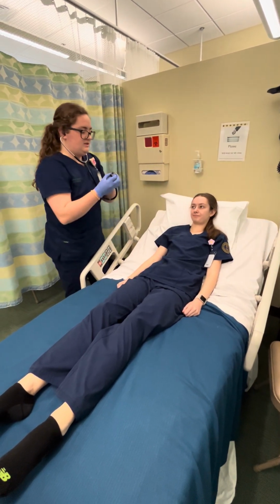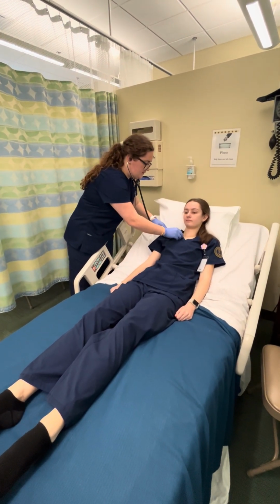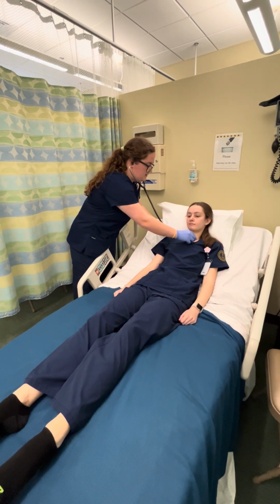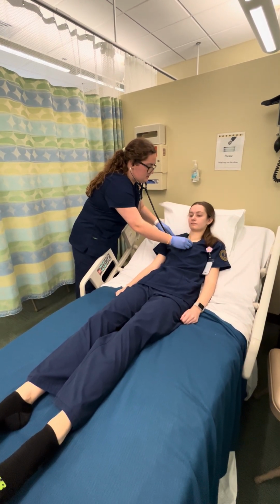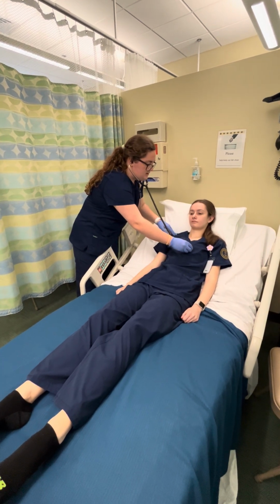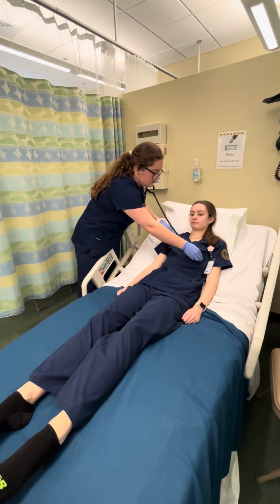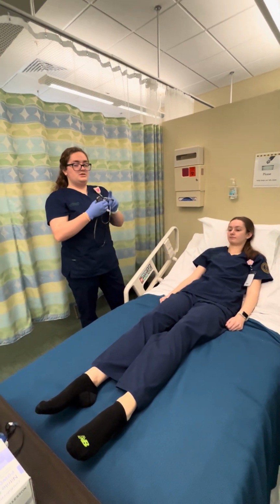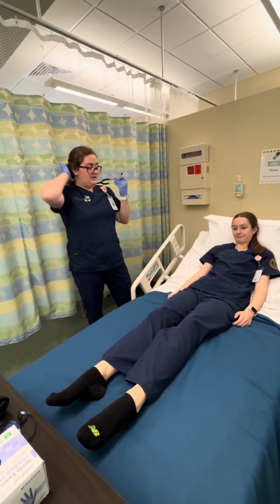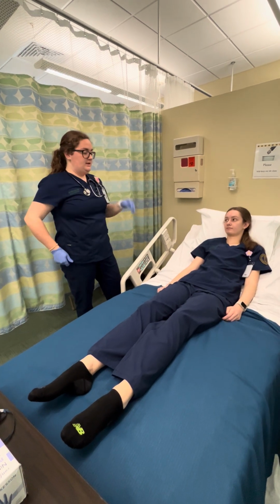Okay, and then I'm going to listen with the bell as well. At aortic, pulmonic, Erb's point, tricuspid, mitral. So heart sounds S1 and S2 were noted, and there were no additional heart sounds, no murmurs that I was able to hear.